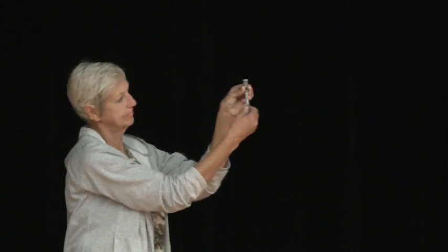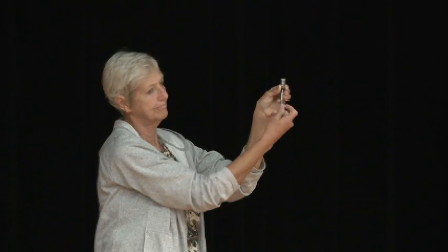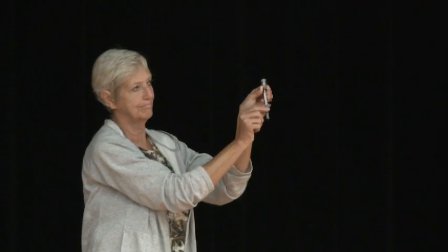So once you've given it a little swirl, you're going to make sure that the vial is the side that's upmost. And you're going to pull back the plunger on the syringe to get the dose that you need. And again, you're going to find that dose on the outside of this container. It's important that you hold it upright like that. There's only going to be 1 cc of fluid in there. If you happen to hold it sideways or vial side down and you create that vacuum by pulling up the syringe plunger, if you don't have it situated right, you might get a syringe full of air. Air's not going to do anybody any good.